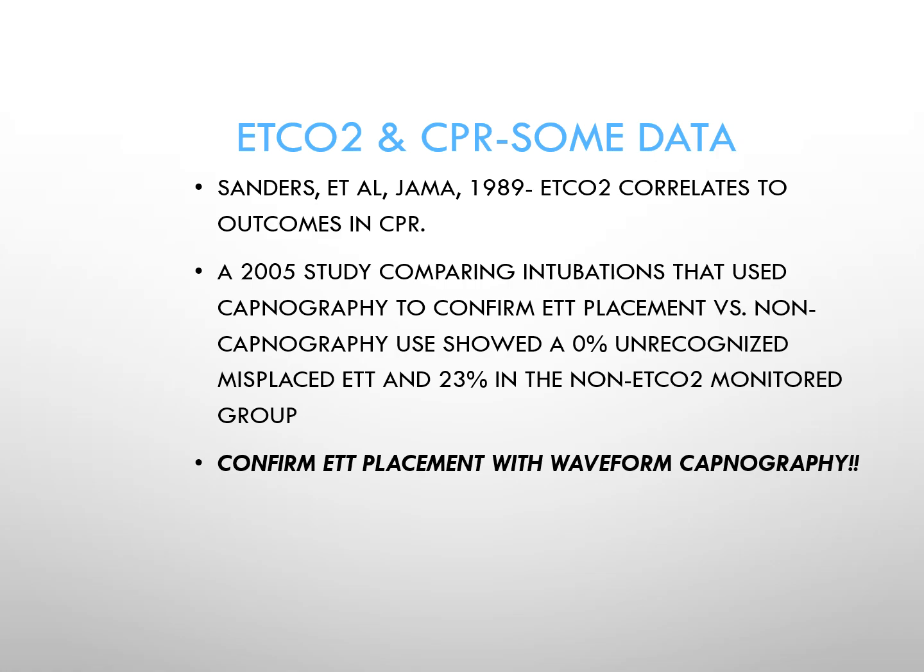Some of the additional research was published, for example, by Sanders in the Journal of the American Medical Association in 1989, where these researchers determined that end-tidal CO2 correlates to outcomes in CPR. I'll discuss some of those thresholds in subsequent slides.